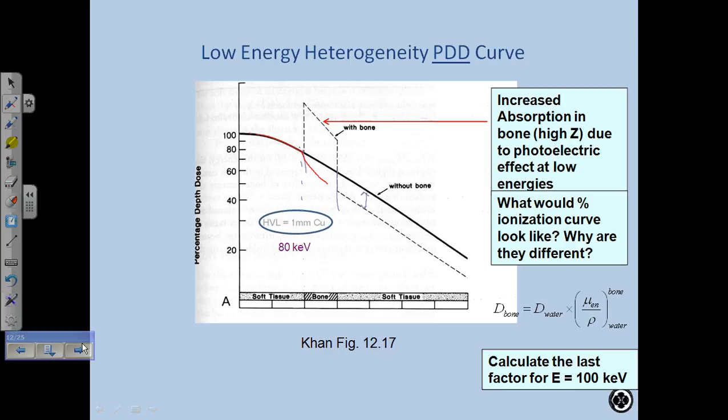You'd see some kind of drop like this, because think about if you're a chamber and you're going through bone, you're experiencing a decrease in intensity because there's more attenuation. Okay. So that's just a hypothetical case. The question that might come up on the board: what would an ionization chamber experience? Or another question is, what's the fluence? What's the photons per cc?